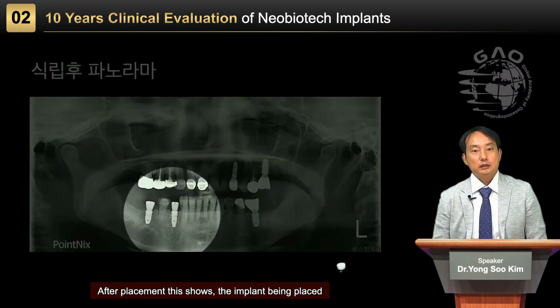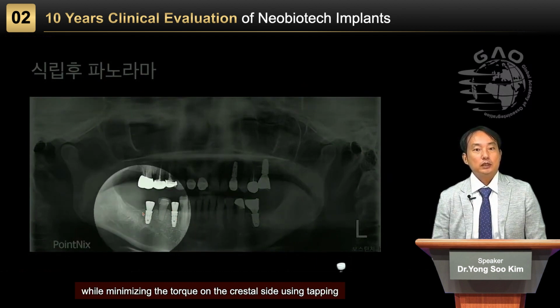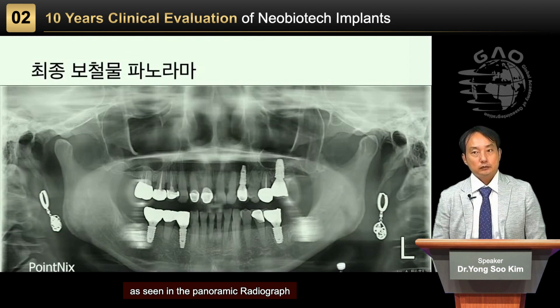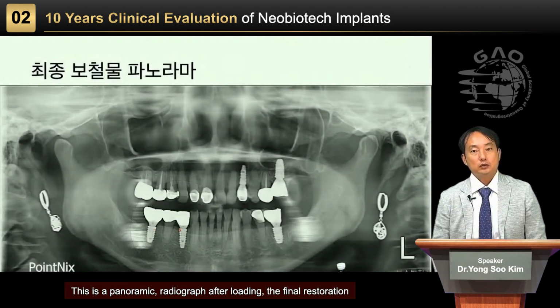After placement, this shows the implant being placed while minimizing the torque on the crestal side using tapping, as seen in the panoramic radiograph. This is a panoramic radiograph after loading the final restoration.